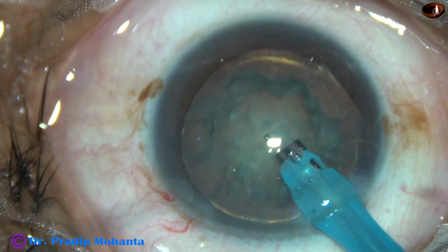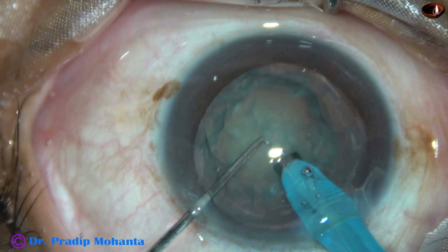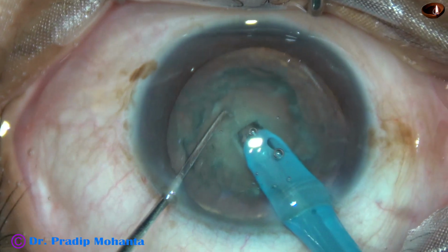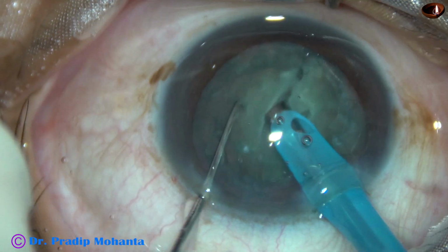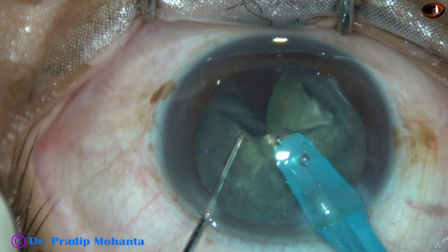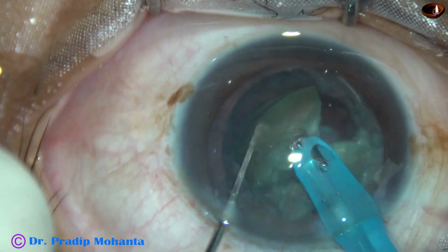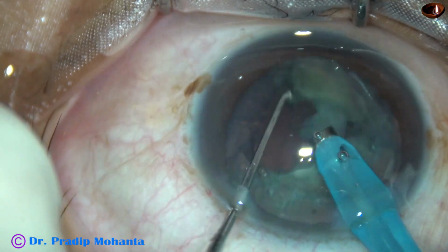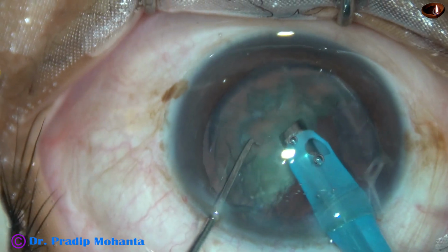Now watch direct chop. In this case we will be able to hold at the center. Yes, here we must not go beyond the center. Beyond the center the nucleus is soft and we may not be able to hold there. So in grade 2 nuclear sclerosis we can hold at the center where the nucleus is reasonably holdable.